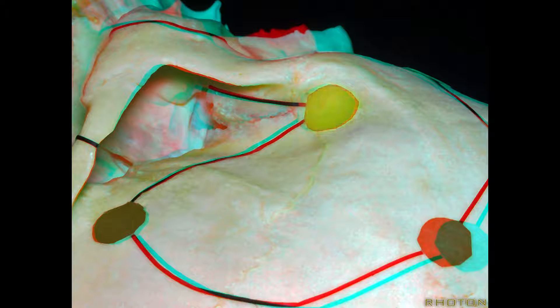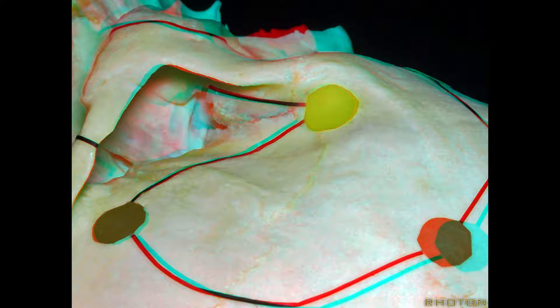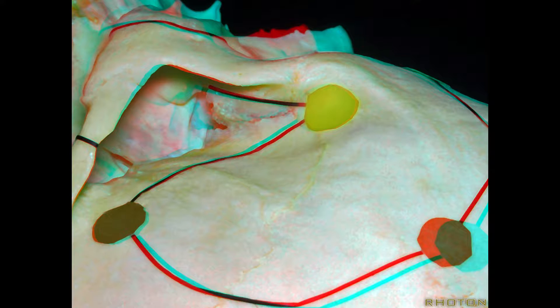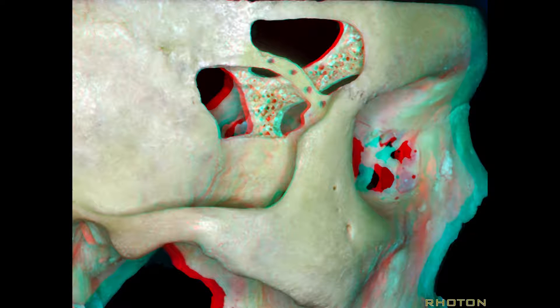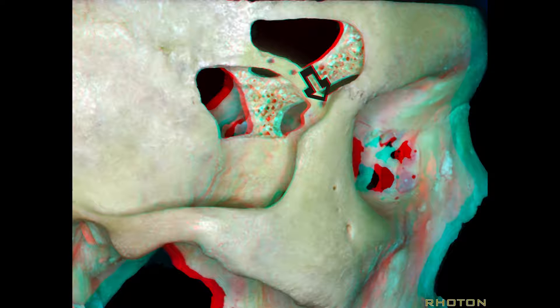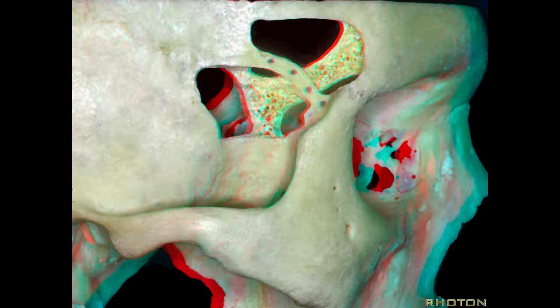For the one-piece orbital zygomatic approach, we want a keyhole, and out of the keyhole we have three cuts: one into the flap, one down into the inferior orbital fissure, and a third cut out of the keyhole along the orbital roof. A properly placed keyhole exposes periorbita on one side, dura on the other side, and the orbital roof in the center. A good place for the keyhole is on the frontal-sphenoid suture, just behind the three-suture junction, where you have periorbita below, dura above, and the orbital roof in the center.